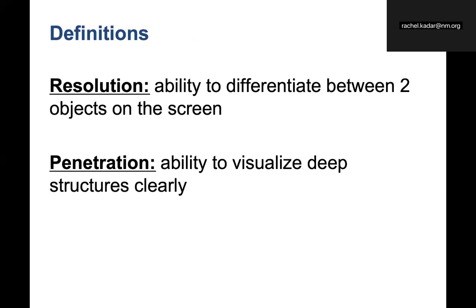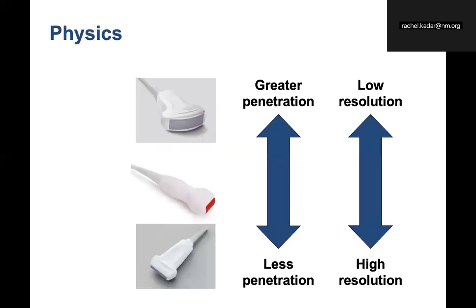Just to review a couple definitions, resolution is the ability to differentiate between two objects on the screen, and penetration is the ability to visualize deep structures clearly. So in general, the higher the resolution, the lower the penetration. This is important when talking about which probe to use.